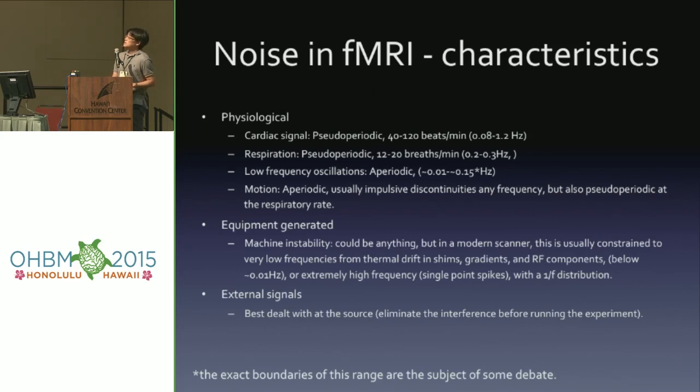The last one is the motion. The motion can be an aperiodic signal because it can be a spontaneous motion like coughing, and most importantly, motion can become a pseudo-periodic signal. This is because some motion is closely associated with your respiration, for example, and some motion is even associated with your task. In those cases, those motions will share the same frequency as your respiration or even your task. Those are the harder problems to deal with.